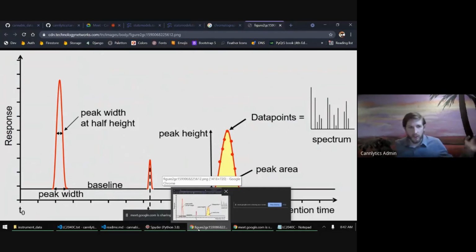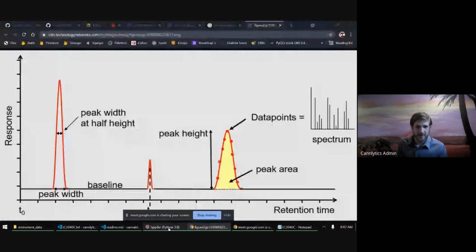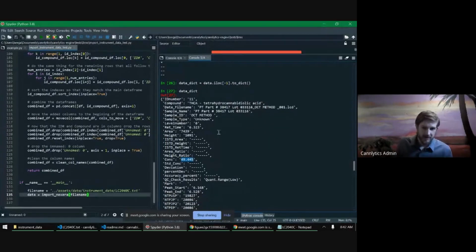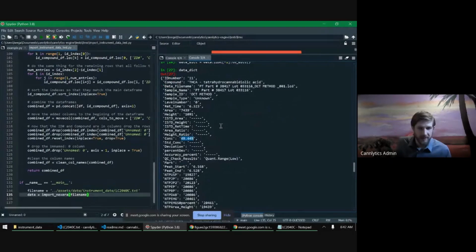Oh, that was injected through the instrument. So those are the main data points you're looking for. Of course, the chemists may be interested in some of the other variables.